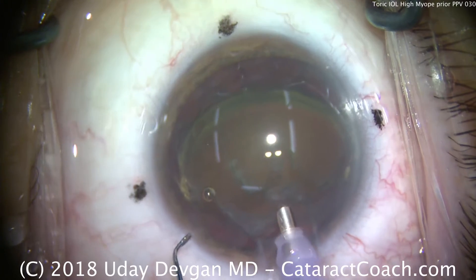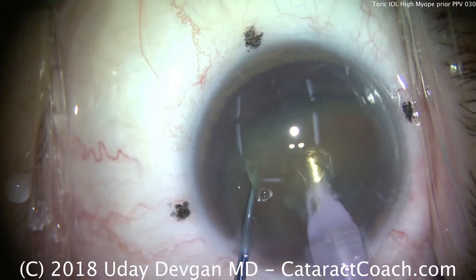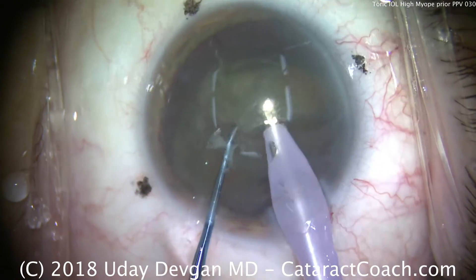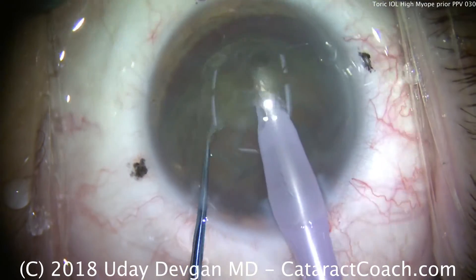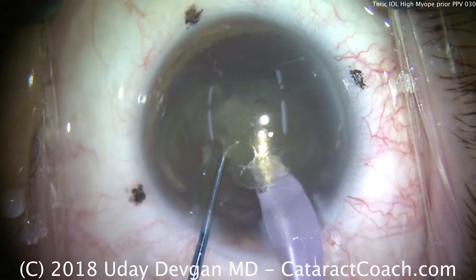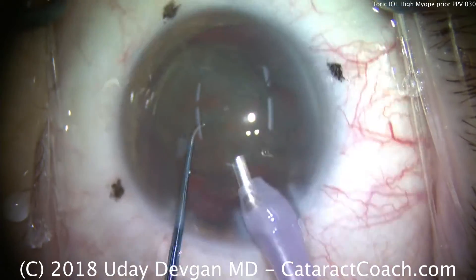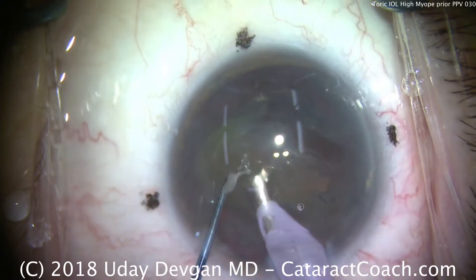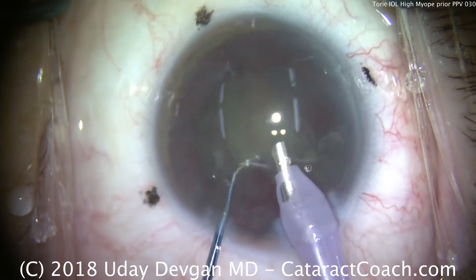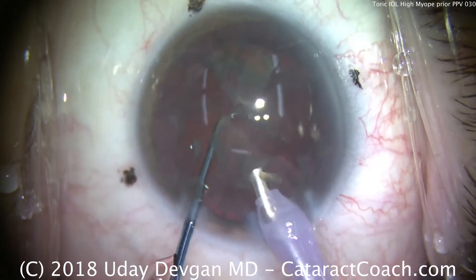The phaco probe is placed in the eye and the AC becomes very deep, often with a reverse pupillary block, but the cataract nucleus is still easily accessible at the iris plane. There's an initial chop and sub-chop, and other pieces are aspirated down with a little phaco ultrasound energy. The key is making the first chop at the very beginning because that breaks the cataract into two pieces, which are easily managed. Here's the second half — chopped again, little piece taken off, aspirated down. Last piece, chopper in a protective position, avoiding the capsular bag.